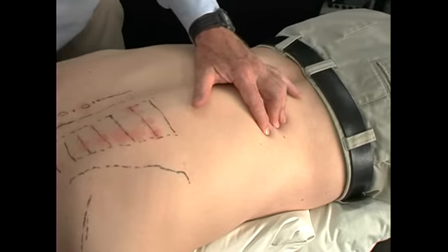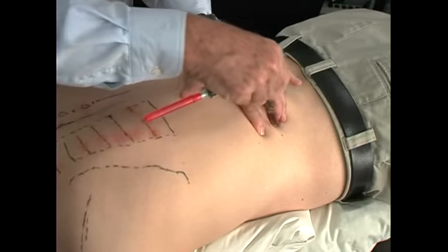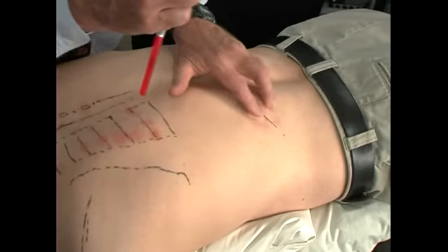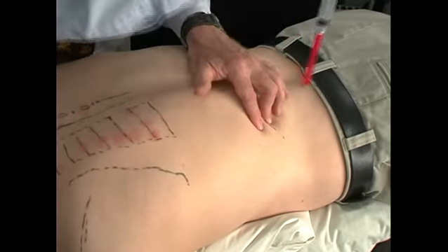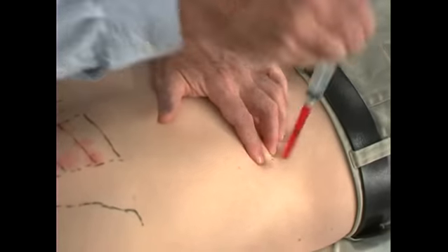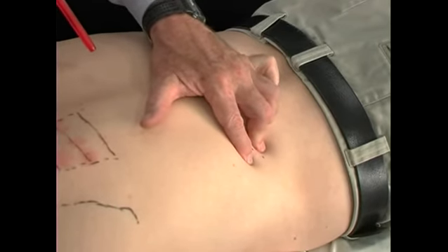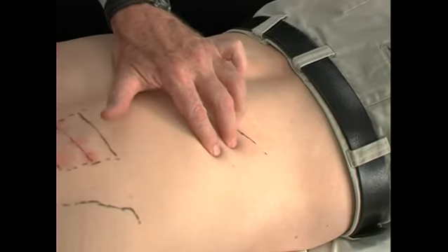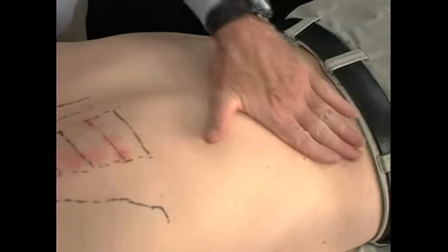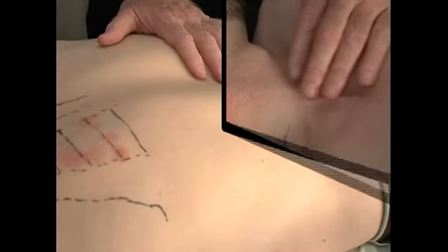again that we've done the other ribs, where we lock our fingers on that rib. We can feel it right there. We may wish to mark that. Carefully palpate the tender areas along it, and usually it's a little bit laterally that we feel it, and then come in with our perpendicular injections directly onto that rib, walking down the rib, again with our fingers locked over the rib, a lot of skin compression, feeling that rib as we go. We may wish to move up to the 11th rib, but more frequently we'll find that this is the 12th rib, which angles down quite a bit there, that's involved with this discomfort down in this area.